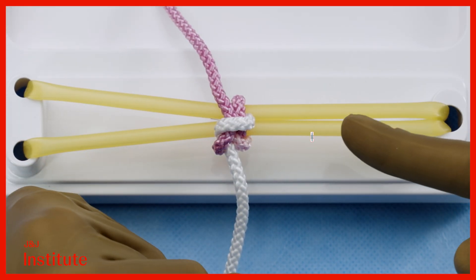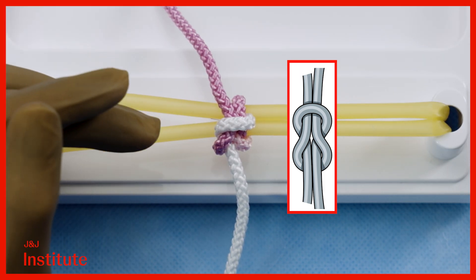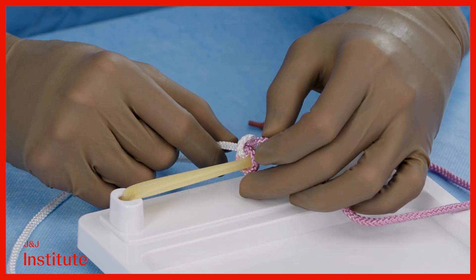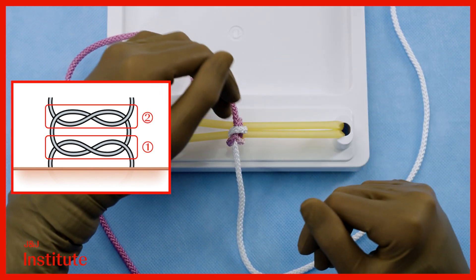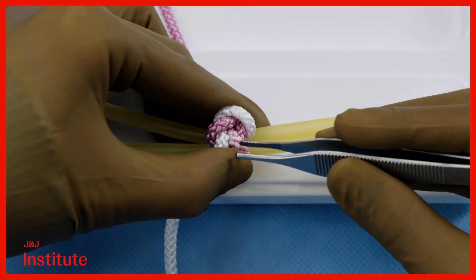In surgery, the reef knot is a commonly used type of surgical knot for tying off sutures. It's a simple yet effective knot that ensures secure closure. This knot involves two layers of half hitches or throws positioned one atop the other, resulting in parallel threads when tightened.